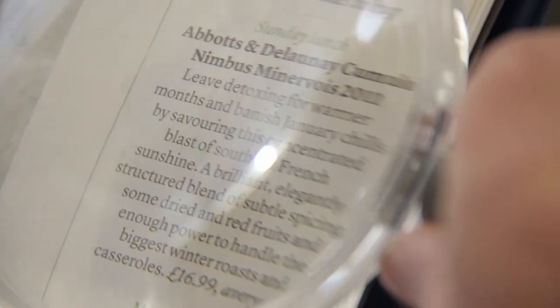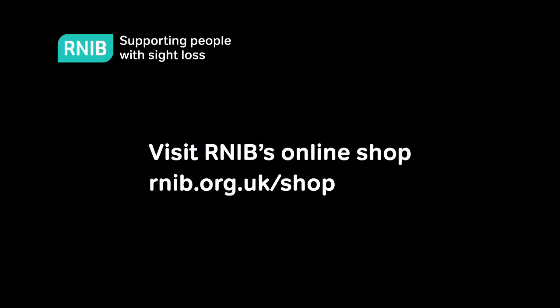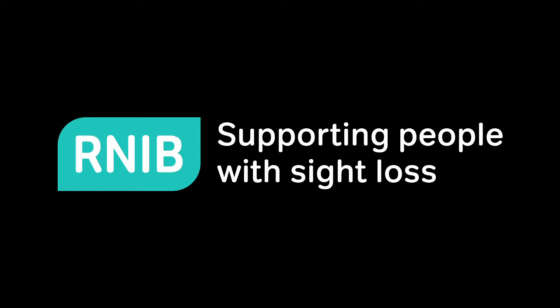There is a wide range of magnifiers available on RNIB's online shop. Visit rnib.org.uk/shop. RNIB — Supporting people with sight loss.